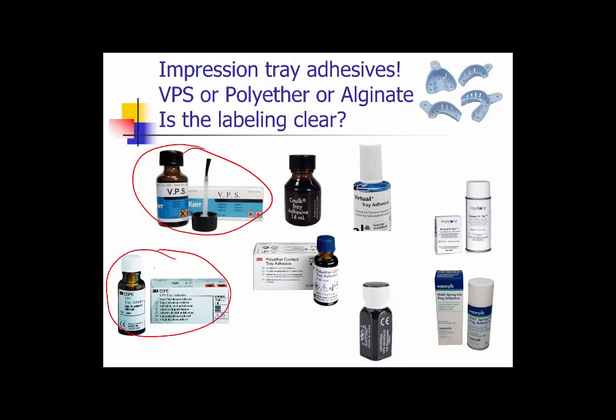These are meant to be used only with vinyl polysiloxane impression materials. But Caulk's tray adhesive, what do we use it for? Well, that's also a VPS adhesive, but it only says tray adhesive on the bottom. And then if you have 3M products in your office and you happen to have a polyether, you use a specific adhesive for a polyether that doesn't work with a VPS.